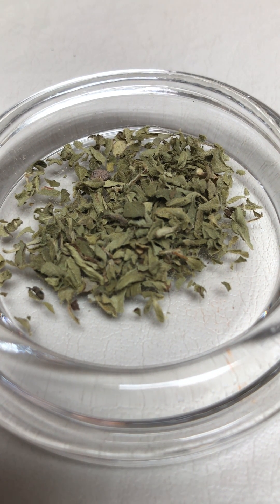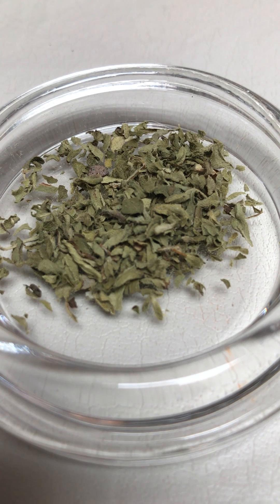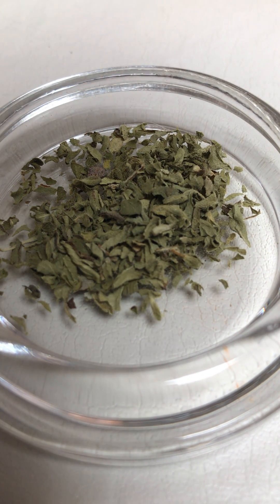So James is gonna help us this time. James, would you mind dispensing some of our hydrochloric acid onto the simulated marijuana? Just drop it all over it.